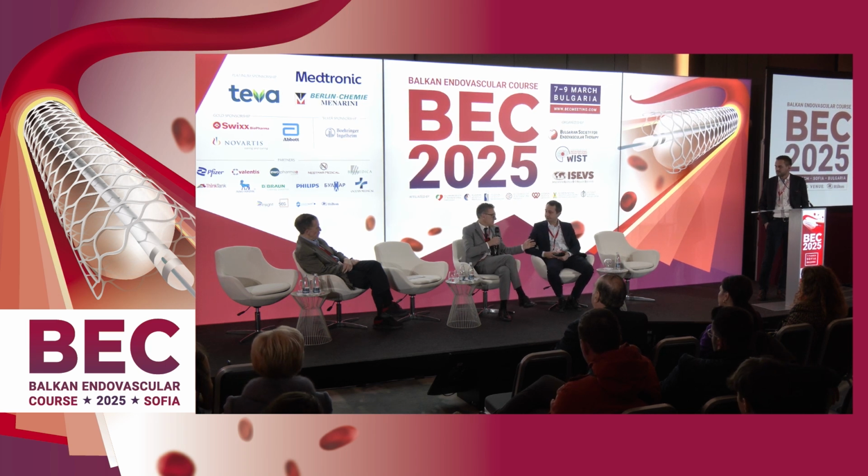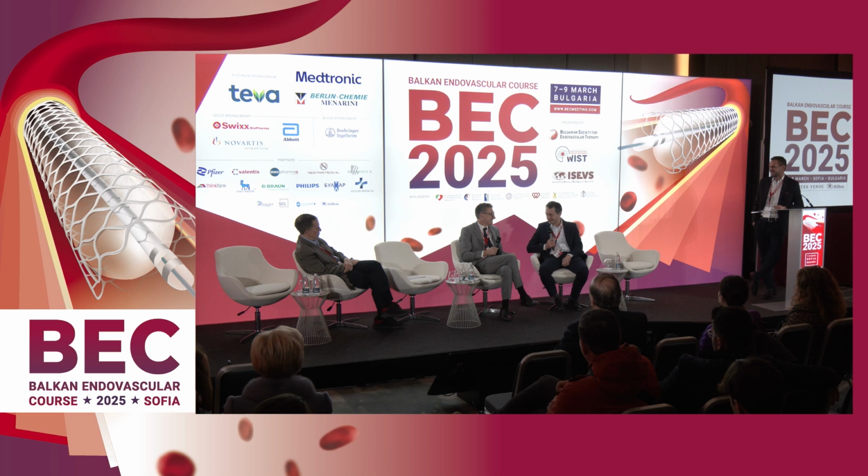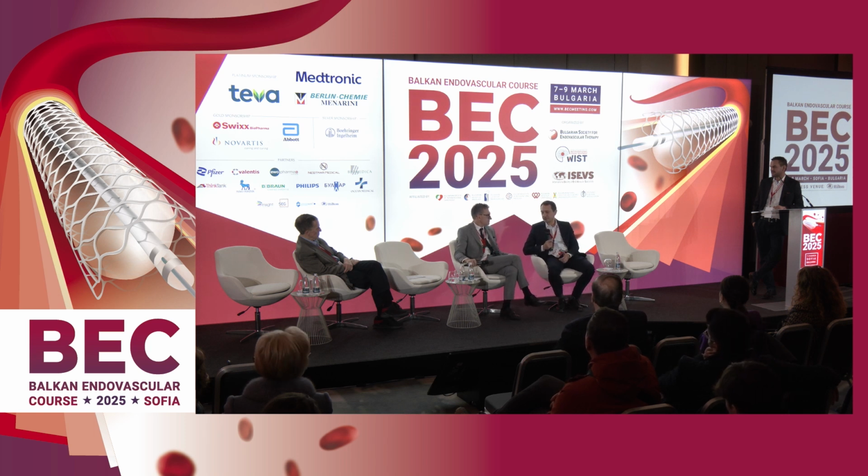Some comments? Are you pro-chimney? Are you pro-fenestration? Definitely pro-fenestration. The main problem with chimneys is exactly what you mentioned. We cannot have proper oversizing in a big neck. So this is a limitation. We cannot treat with 3 or 4 chimneys more than a 26, 28 aortic neck. Absolutely. I'll show you tomorrow for the chimneys in the arch that we are routinely using chimneys for more than 5 years and fenestration for one year, but in situ fenestration, not physician-modified. Never mind, you prefer fenestrations now, right?